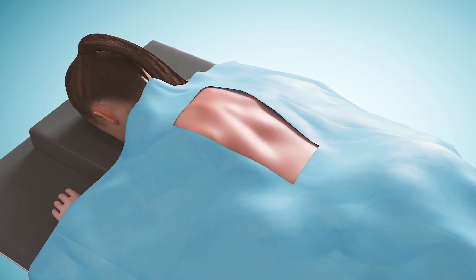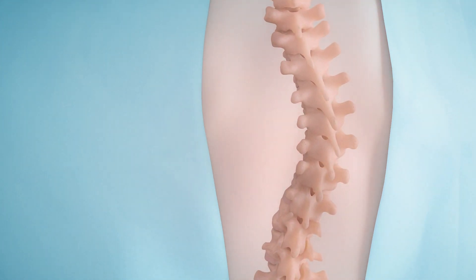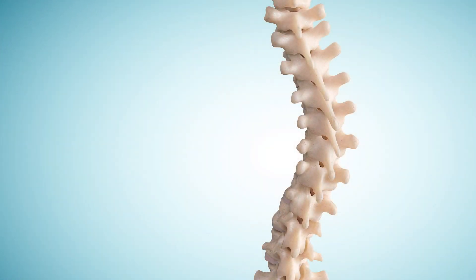Utilizing a standard midline incision, the concave side of the curve is exposed. An APAFIX screw is inserted in the lowest instrumented vertebra. Two polyaxial pedicle screws are placed in the two upper instrumented vertebrae.